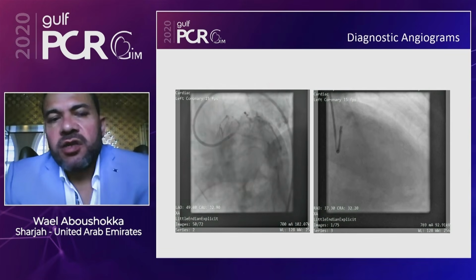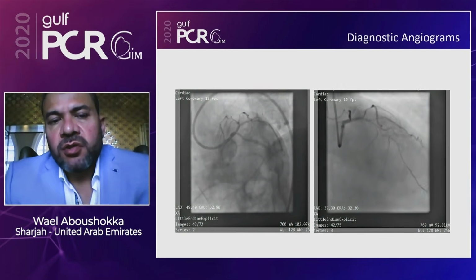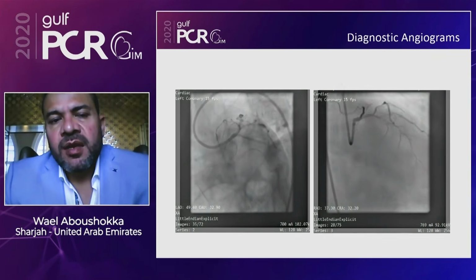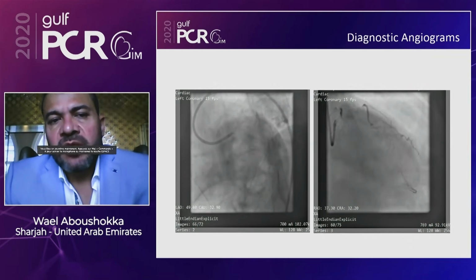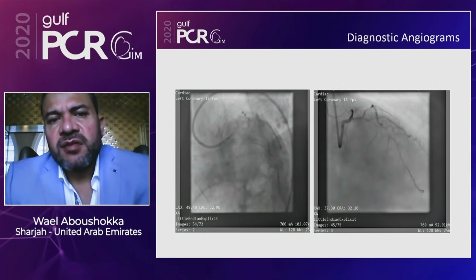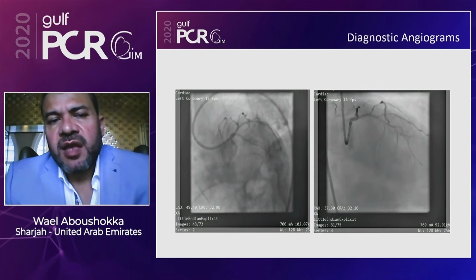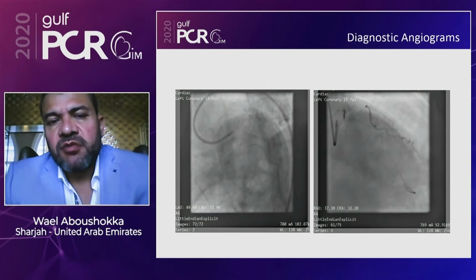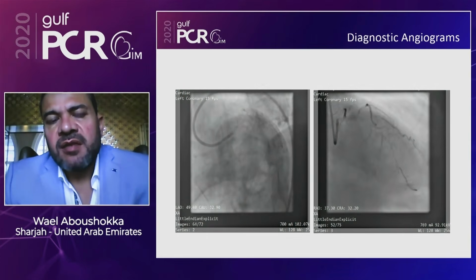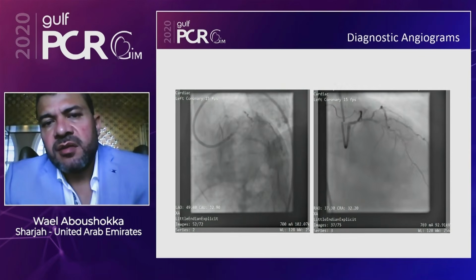His coronary angiography showed normal right dominant right coronary, and the left main was normal, LCX was normal, LAD showed non-significant disease from its ostium with severe lesion at the proximal segment with bifurcation with D1, and the severe calcific lesion extending to the distal segment.